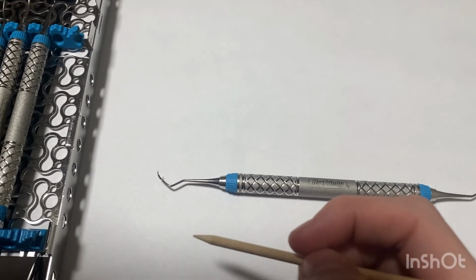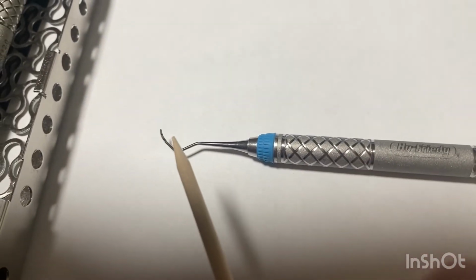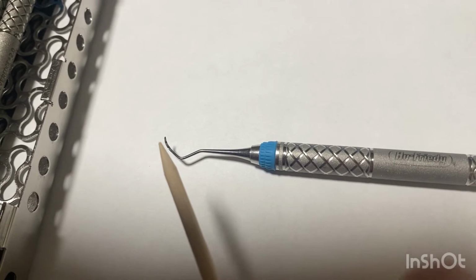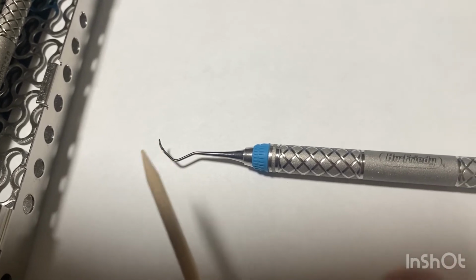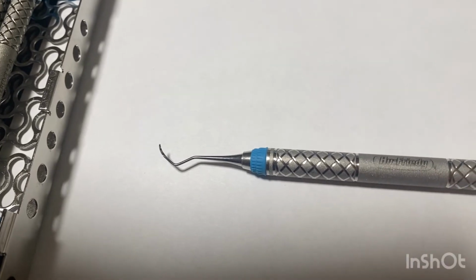As you can see, this instrument has a rounded toe working end which has two cutting edges on either side. The cutting edge is at a 90-degree angle from the terminal shank.